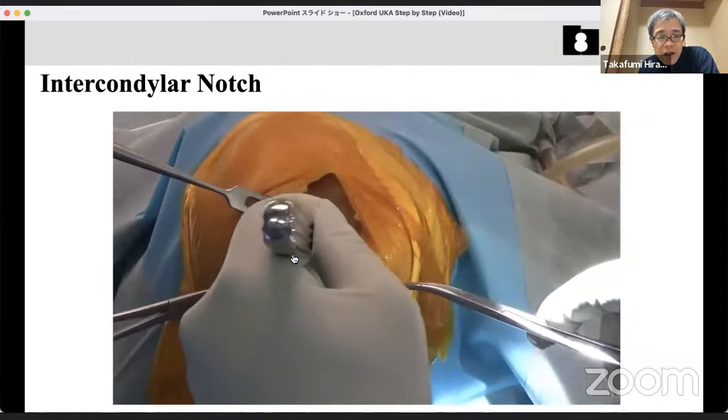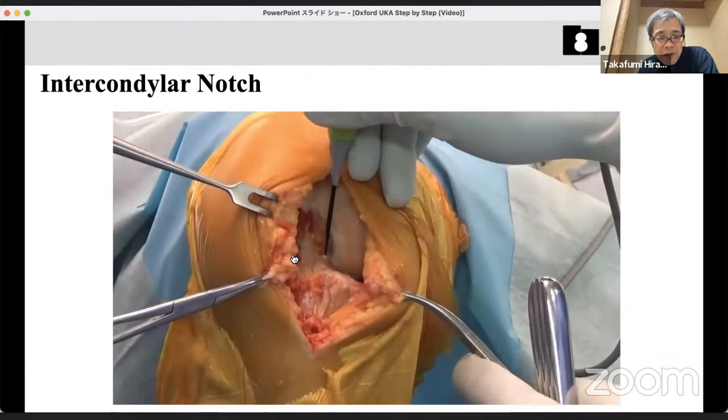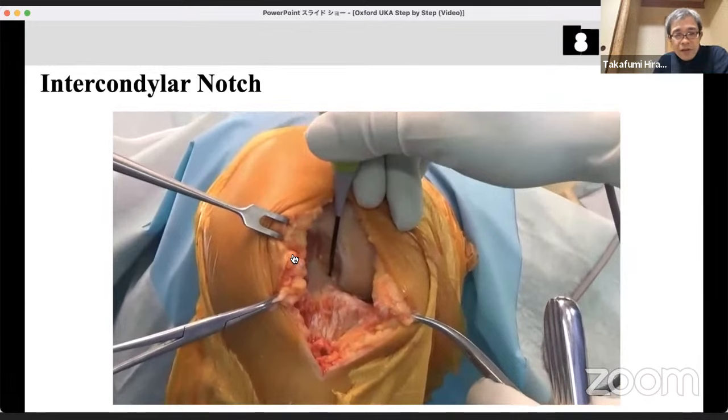Insert an elevator between the PCL and the medial condyle to make space for the sagittal bone cut. Using an electric knife, mark the top of the medial tibial spine — that is the target of the sagittal tibial cut. This mark acts as a saw guide. The best point is just medial to the top of the medial tibial spine. Making this mark prevents the saw blade from slipping through the medial tibia.